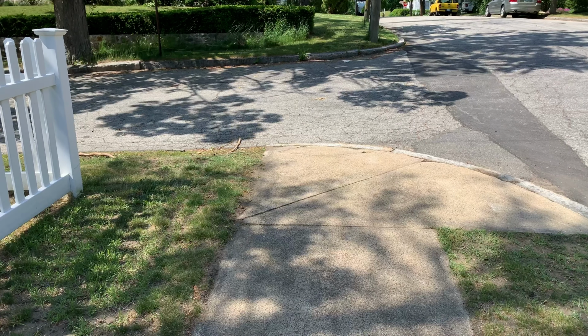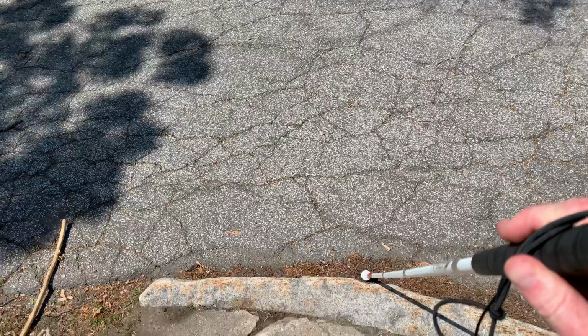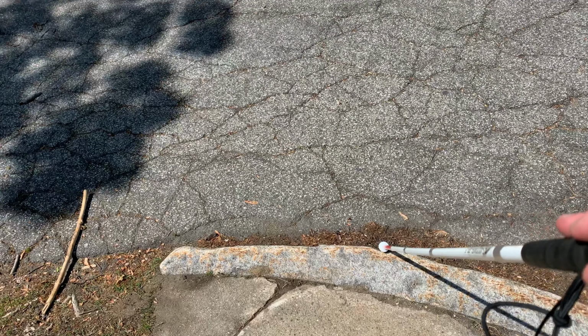And to do that, if you're using 2-point touch, you're going to want to switch to either touch and slide cane technique or constant contact. So for this demonstration, I'm going to use constant contact and show you what it looks like when the cane tip drops off the edge of the curb. So I'm doing constant contact, walking along the sidewalk, coming up to the corner, and I just felt my cane tip drop off the edge. So there's a good 4 or 5 inches between the top of the curb and the street.